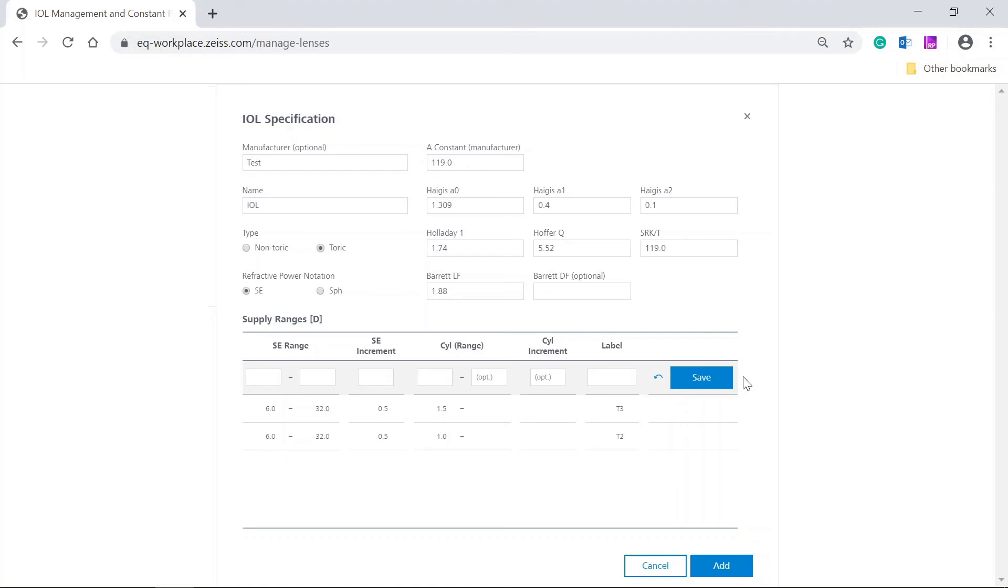To delete a line from the list, hover over the line you want to remove until it is highlighted in light blue. Click on the remove basket that appears next to the label field.